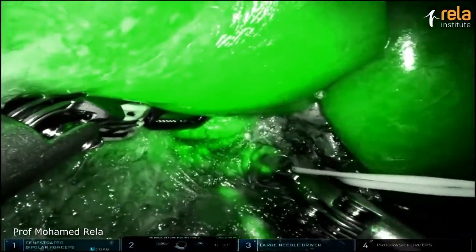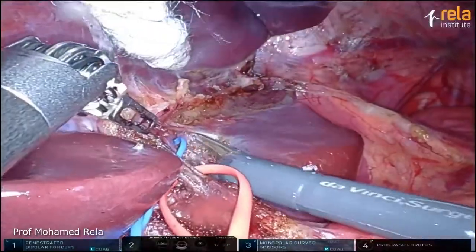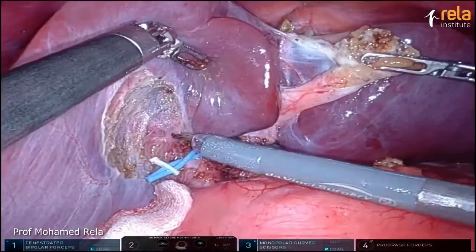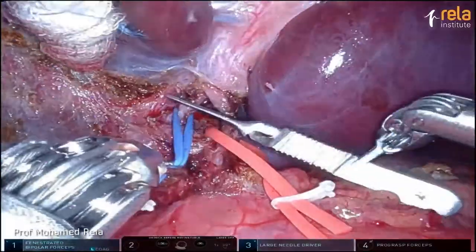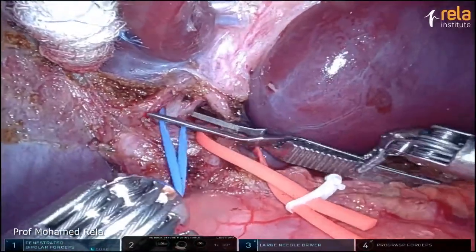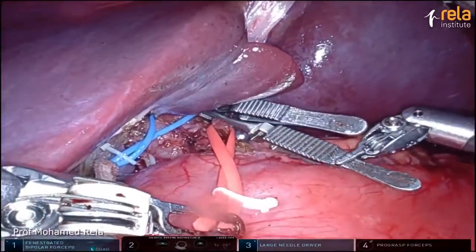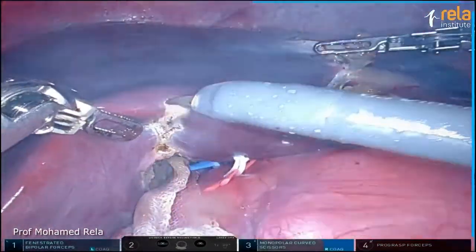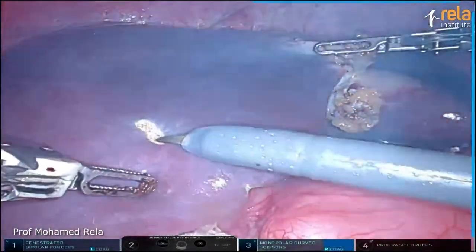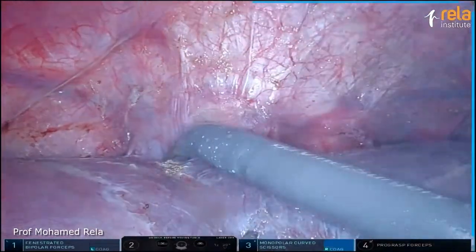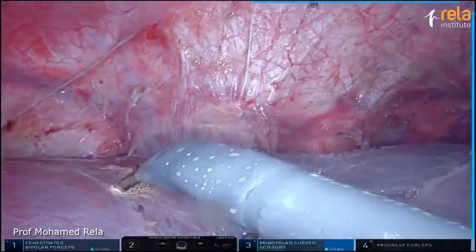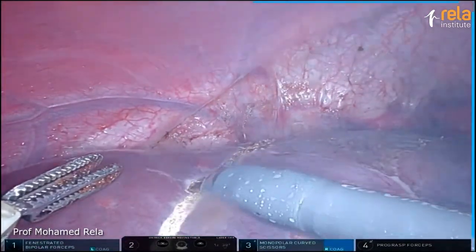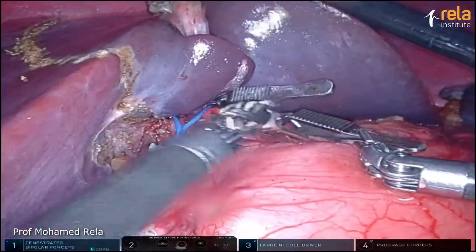You can see there is a caudate duct in the back as well — this is what we isolated earlier and we're just dividing it with the vessel sealer. Putting a hard bulldog on the portal vein and a slightly softer bulldog on the artery. You can very clearly see the demarcation here. The transection plane is being marked now. And the bulldogs are taken out.